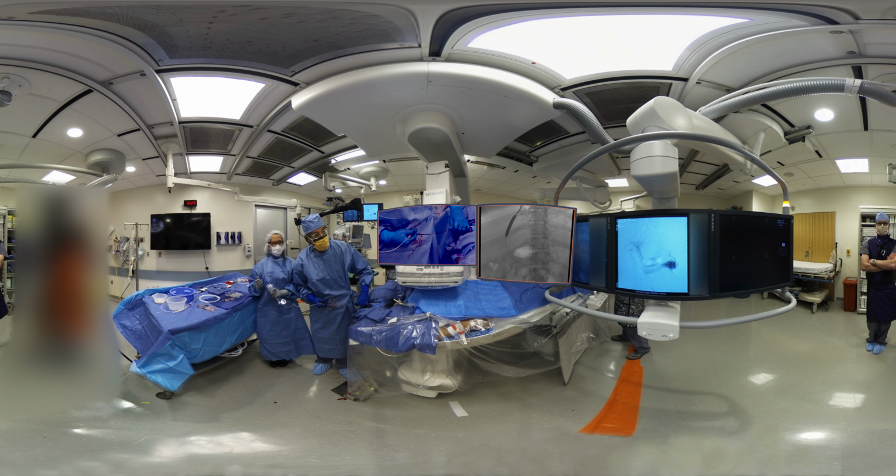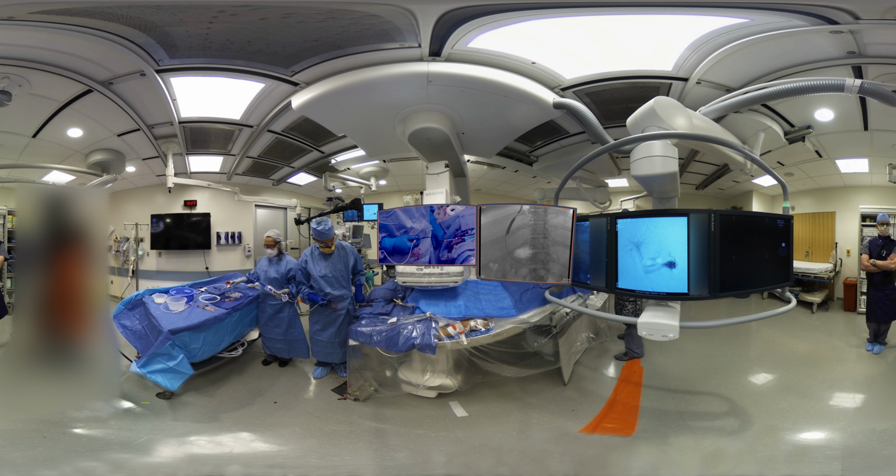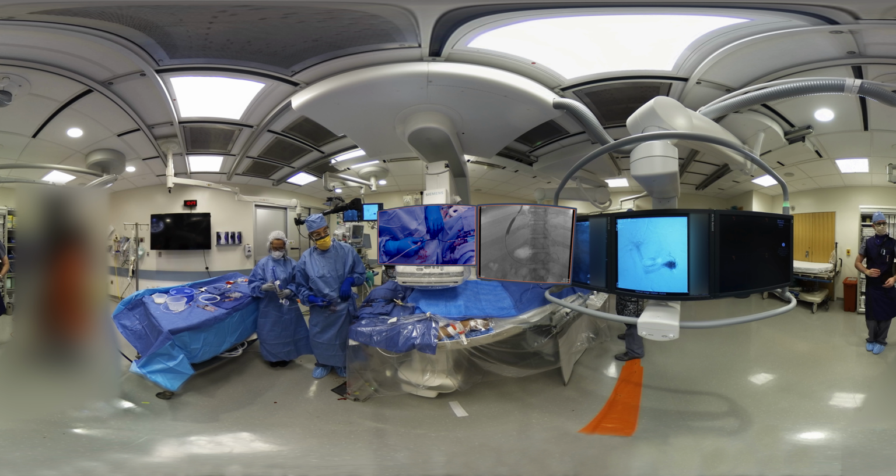Things were tight, as expected. Okay, and now we'll deflate. It's up to you whether to dilate that more than once. I don't necessarily see the necessity, but we will do one important thing once the balloon has been deflated. We'll wait for that, and that's rule number 2, keep the sheath down.